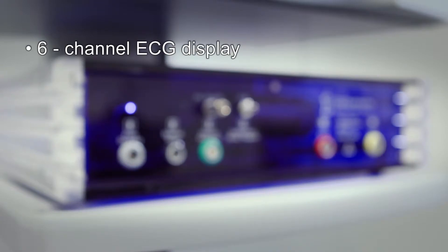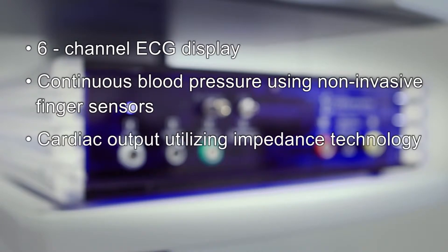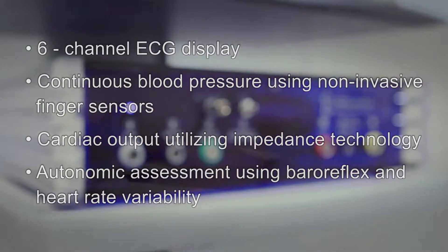A six-channel ECG display, continuous blood pressure using non-invasive finger sensors, cardiac output utilizing impedance technology, and autonomic assessment using baroreflex sensitivity and heart rate variability.